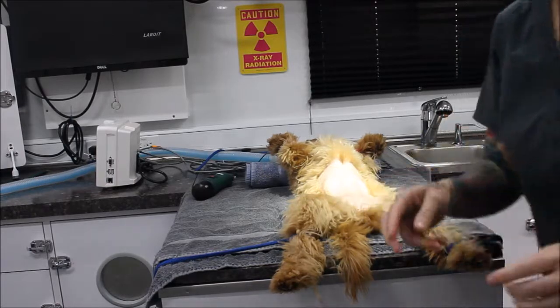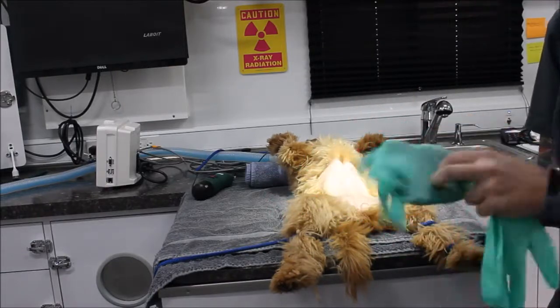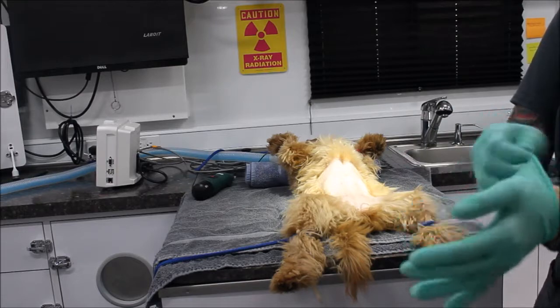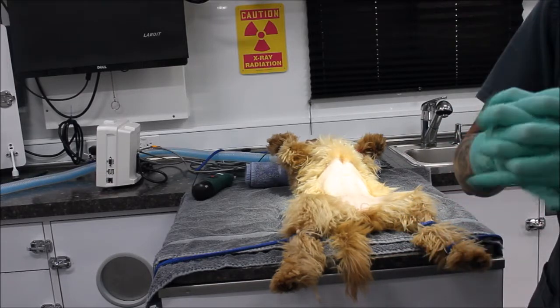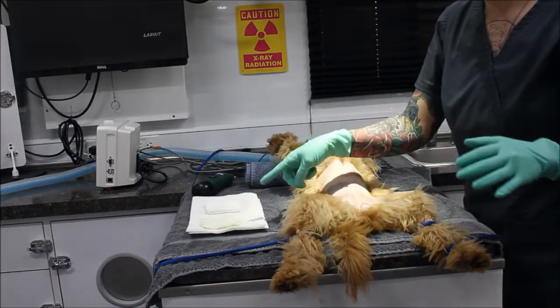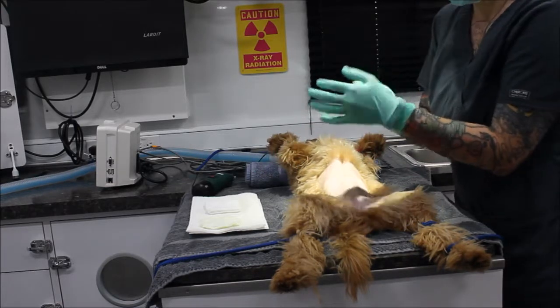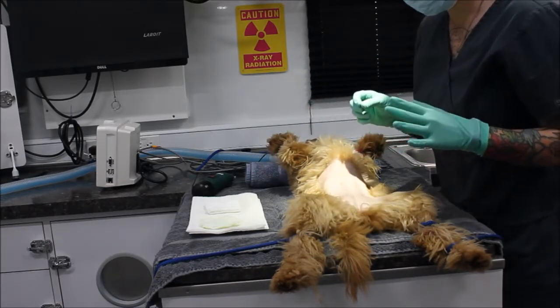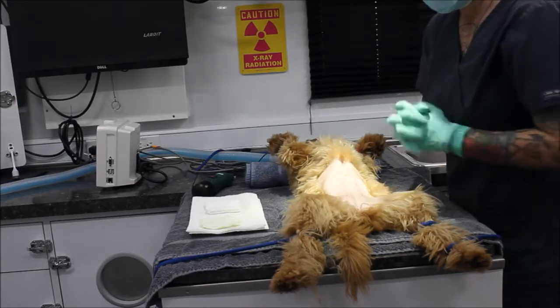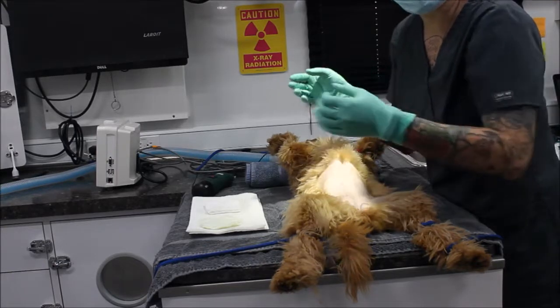Now that I've got that ready, I'm going to go ahead and put my exam gloves on. I have my scrubbing solution and my rinsing solution. I have 2% chlorhexidine gluconate as our scrub, and for our rinsing agent we're going to use 70% isopropyl alcohol. For our initial dirty scrub, we're going to do a minimum of three times in a target pattern, starting with the scrub followed by the rinse — minimum of three times or until they come up clean. Then after we finish this, we're going to move her into the OR and do our final scrub.